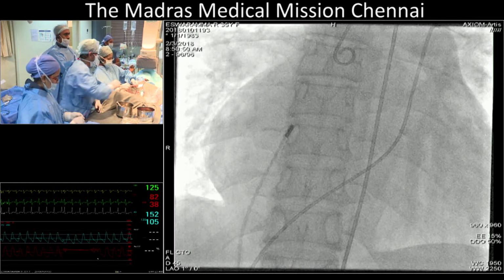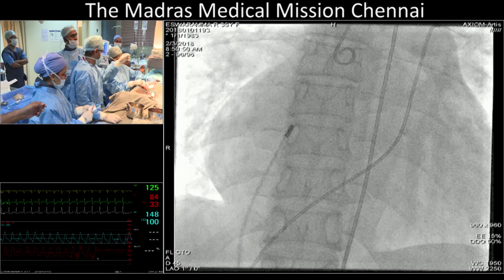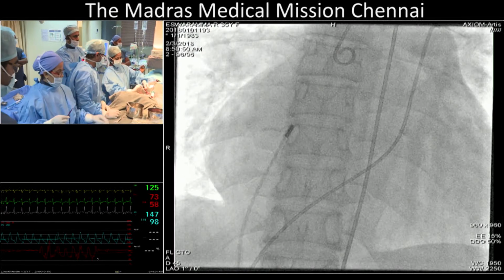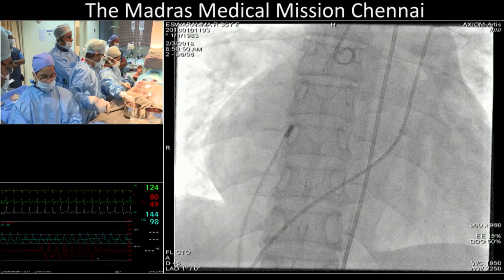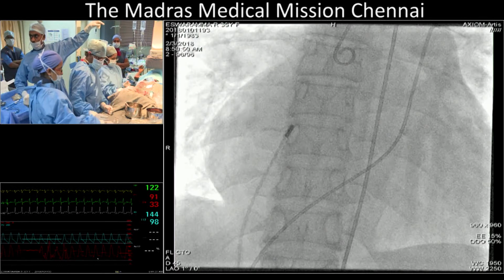Okay, so an interesting, challenging case, one that we are faced with fairly frequently, in particular in Asia and the Far East. Bharat, you're an expert on these. What do you think of the hemodynamics and the size of the ASD? Show the PowerPoint once again.